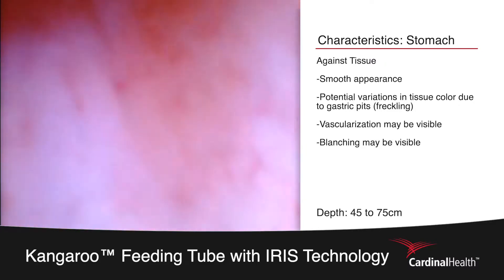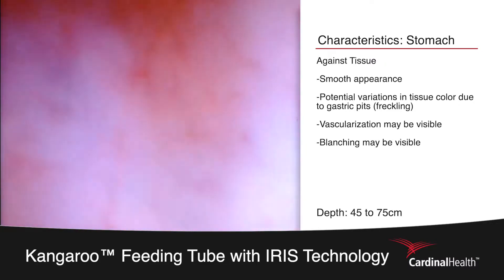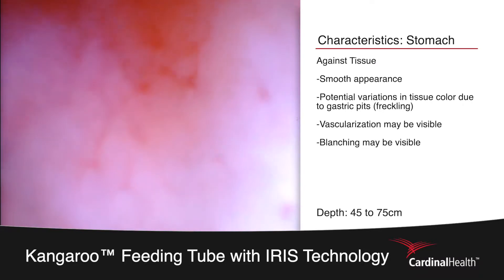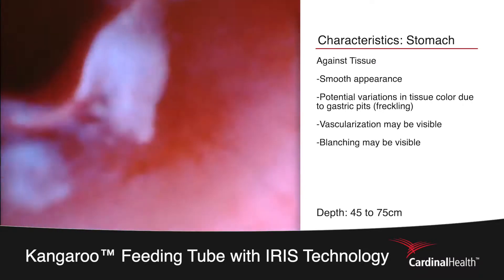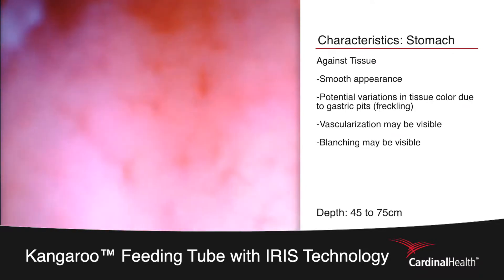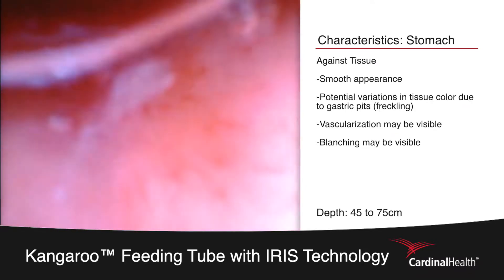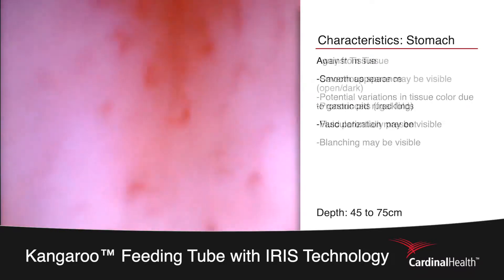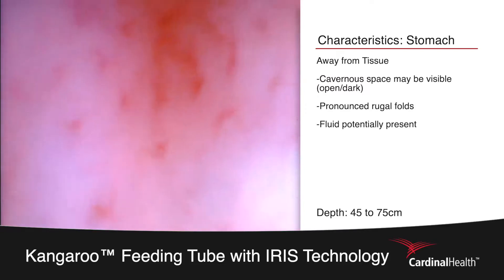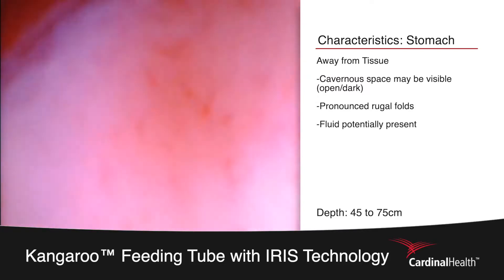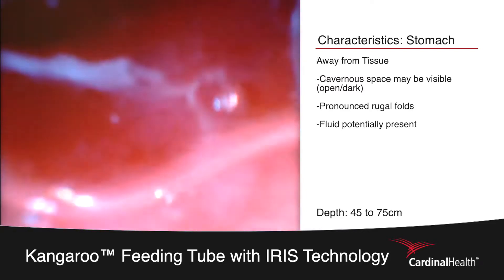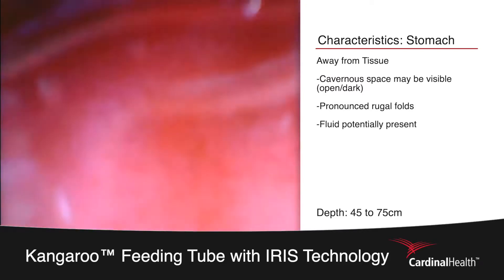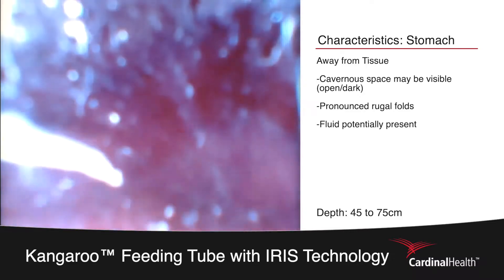In order to visualize a larger view of the stomach, you can retract the tube away from the lining of the stomach, or add air utilizing the insufflation device. This will allow you to visualize the large, regular rugal folds, as well as the dark cavernous nature of the stomach.